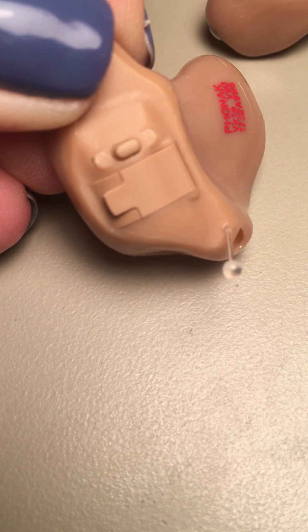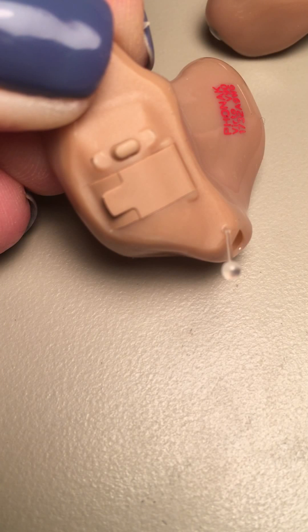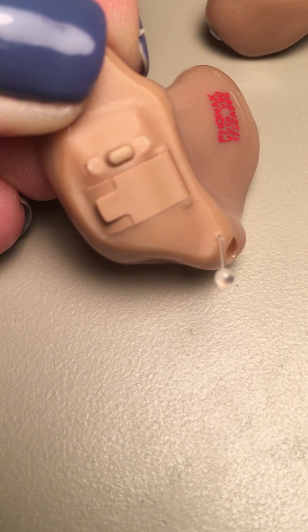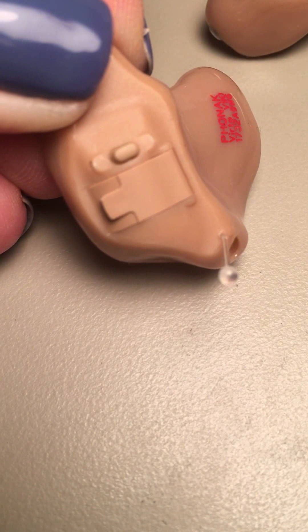This button up here at the top — for some hearing aids, I just completely turn it off. What it does is it just keeps the person from pushing that button accidentally.